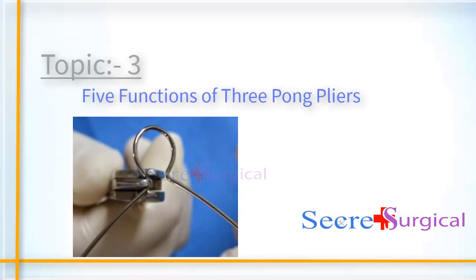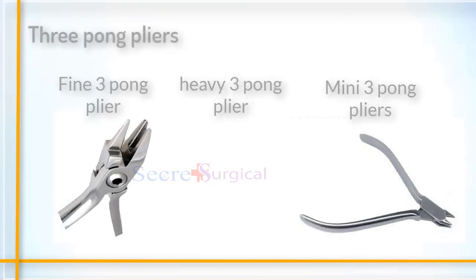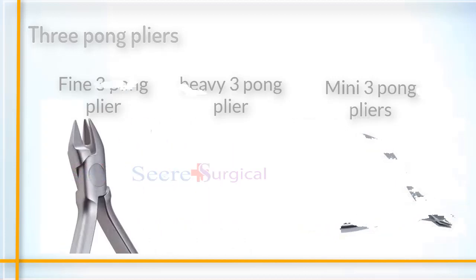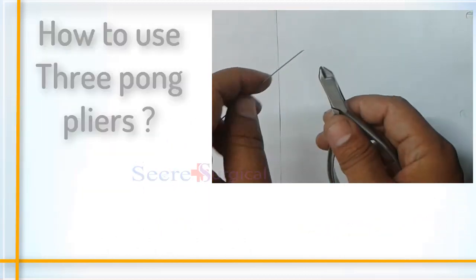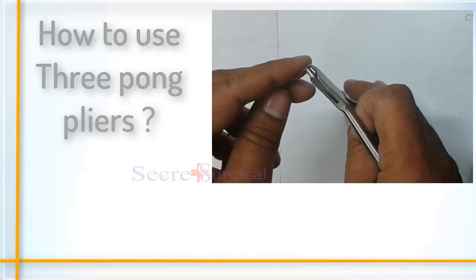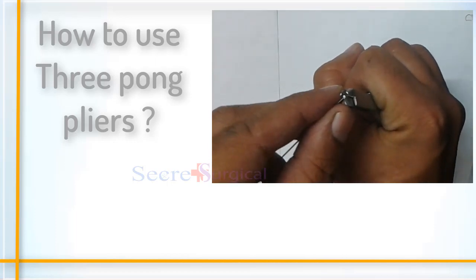There are five functions of three-prong pliers. There are three types: heavy three-prong pliers, mini three-prong pliers, and fine three-prong pliers, used according to the diameter of wire or procedure. Just put the wire into the wire jaws and press until the required shape is formed.